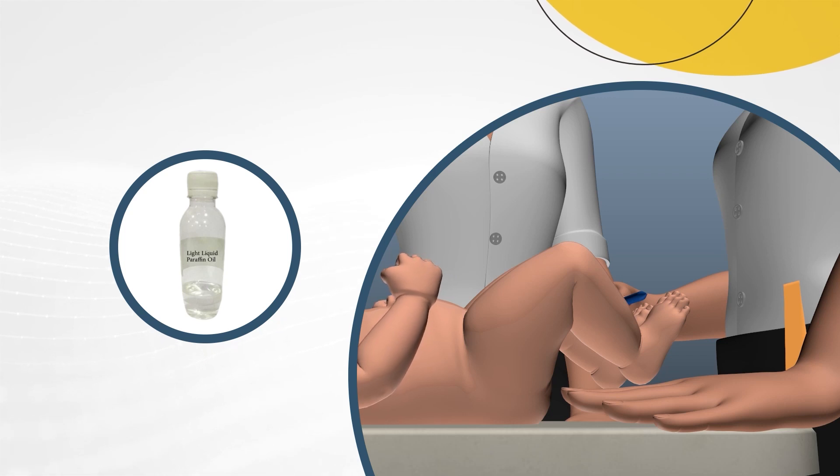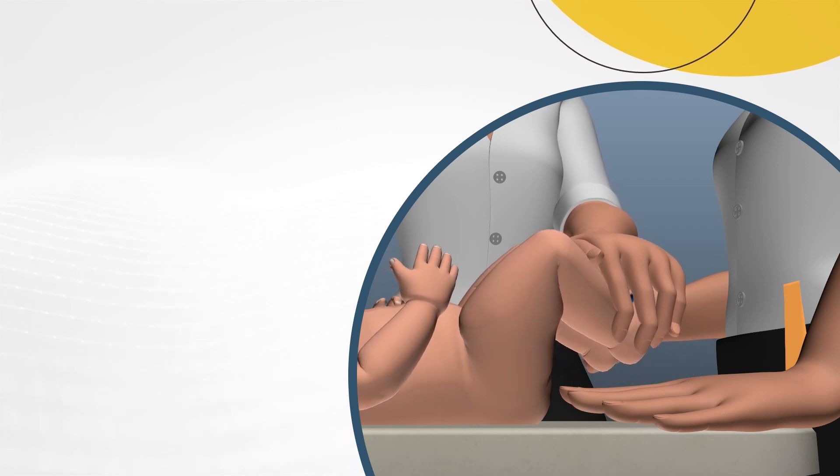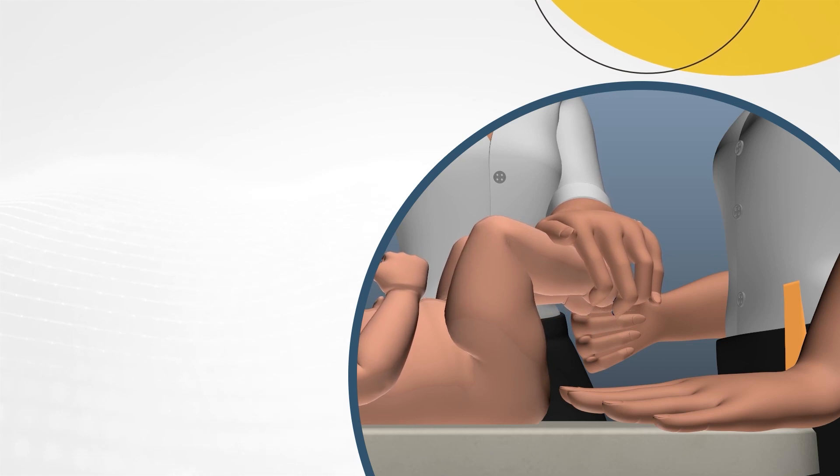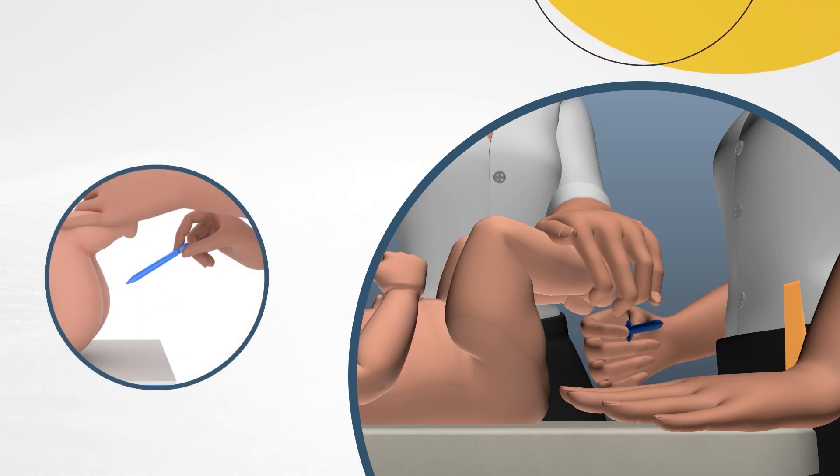Position the child in the position as changing their diaper. That is, gently bend their legs at the ankles over the stomach, giving you a clear view of the anus. Hold the lubricated dilator between your fingers and thumb like holding a pen at the grip designed for that, and gently push the dilator to insert into your child's anus.